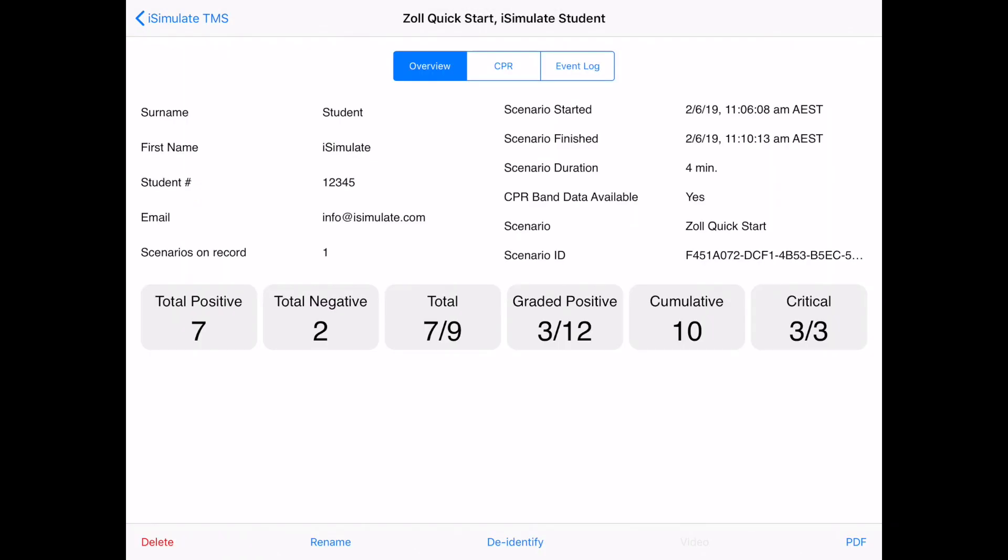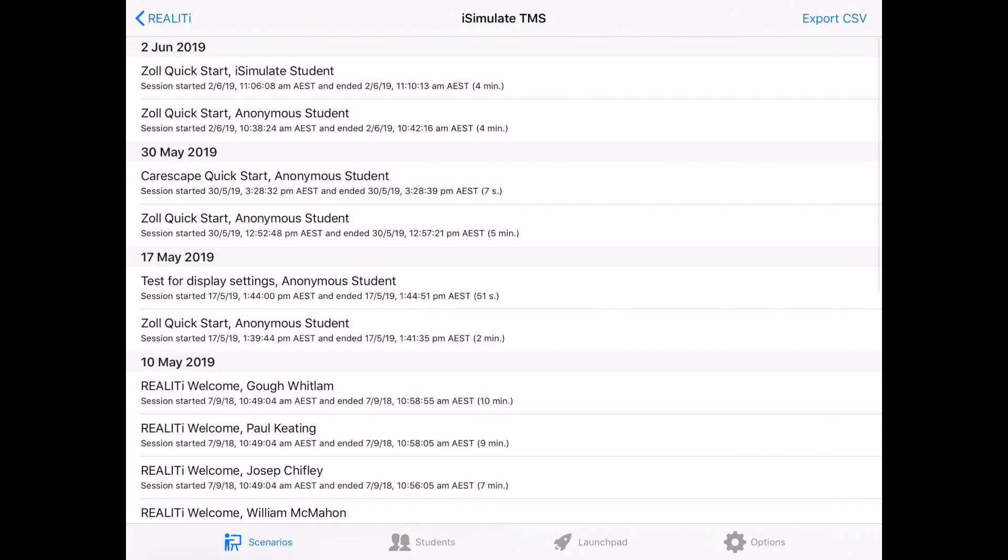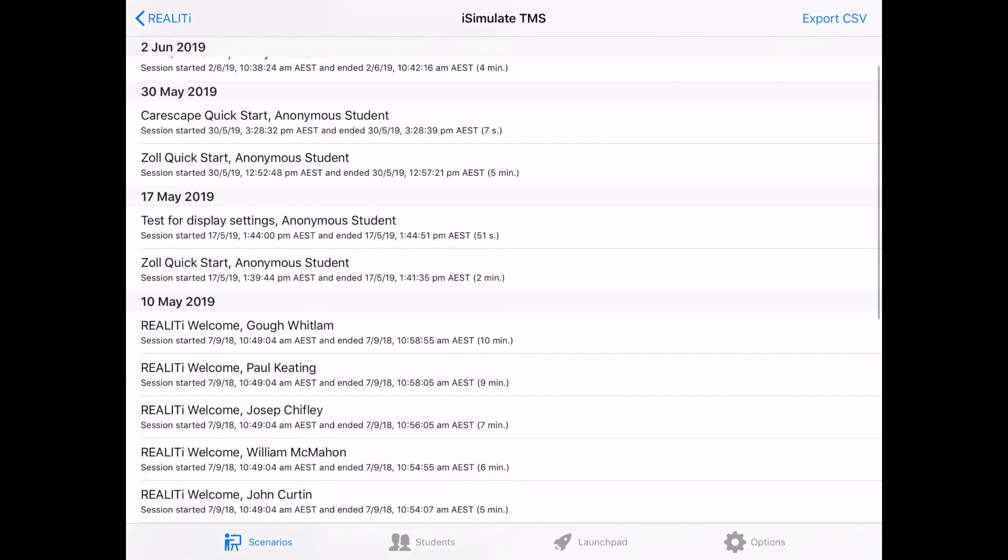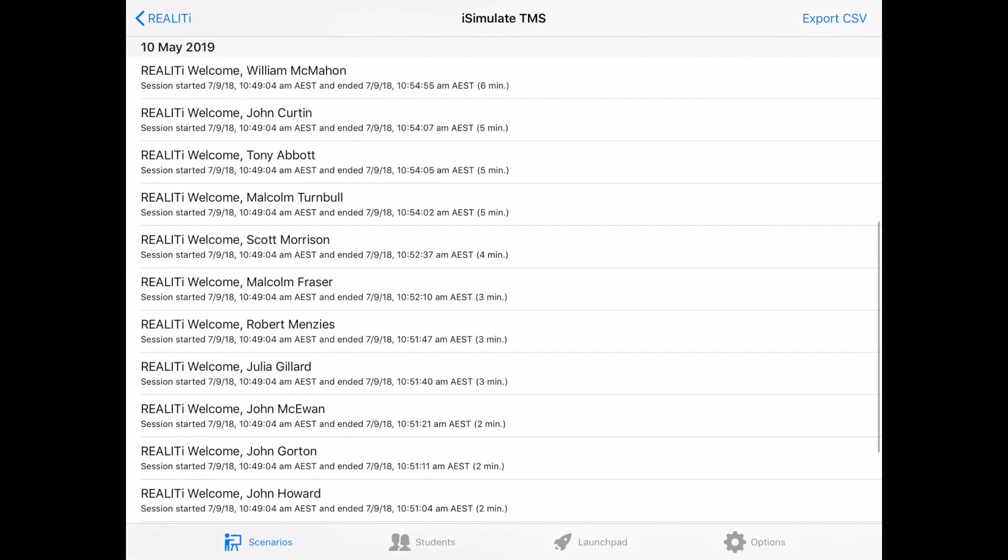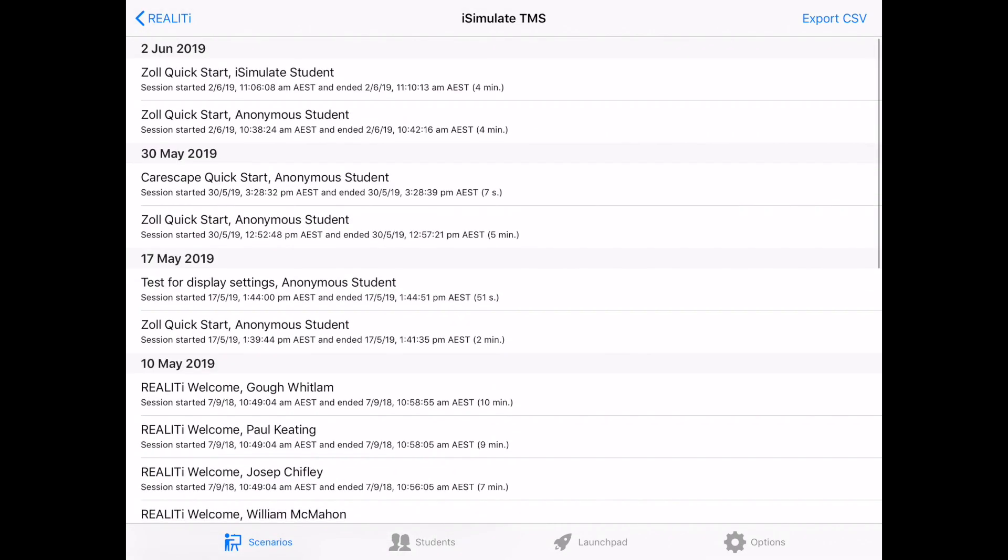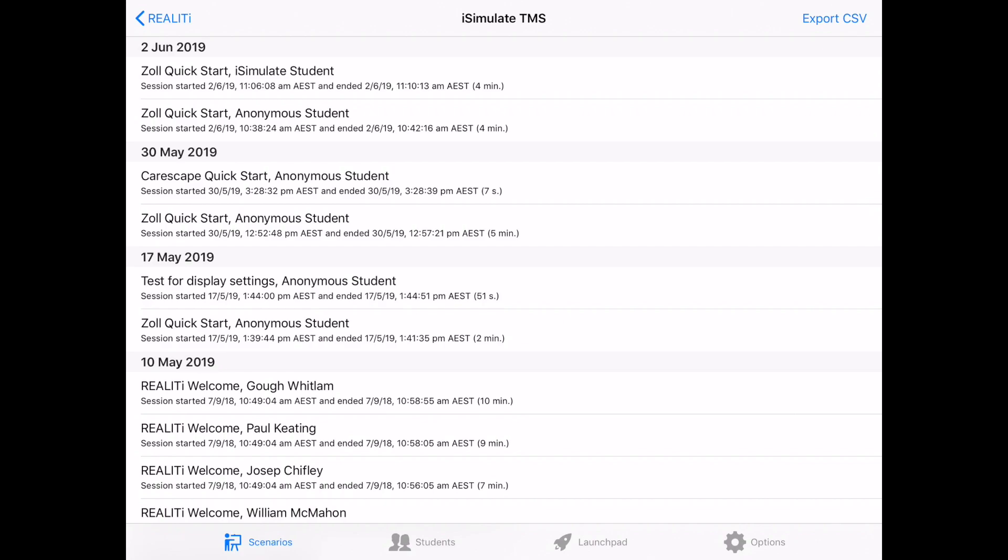So let's jump back to the TMS itself. And here we can see the scenario screen, which you've already had a look at, showing all the various scenarios that we've been running. And they're all saved here. You can click on one of these and have a look at them as we've just done.